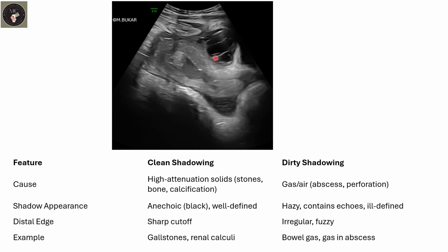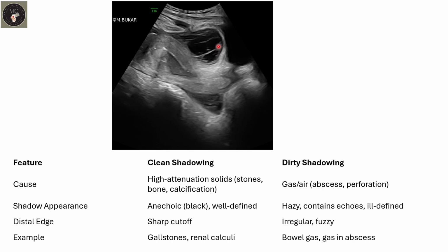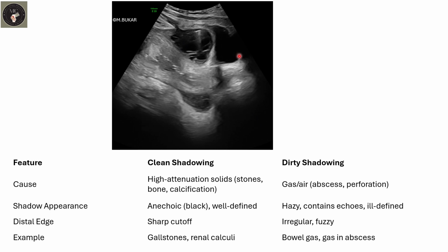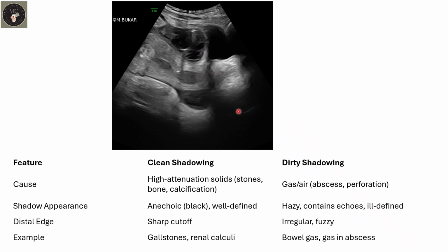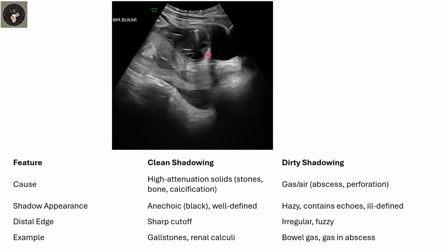Now let's pay attention here and we see dirty shadows. You see that? Dirty shadow from abscess, perforation, hazy, irregular.